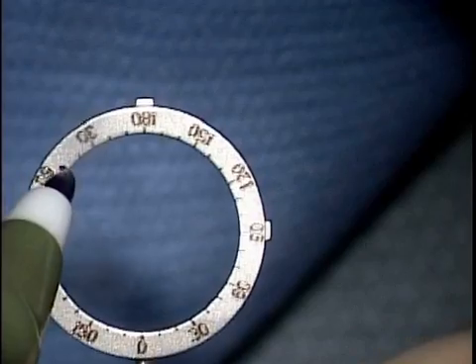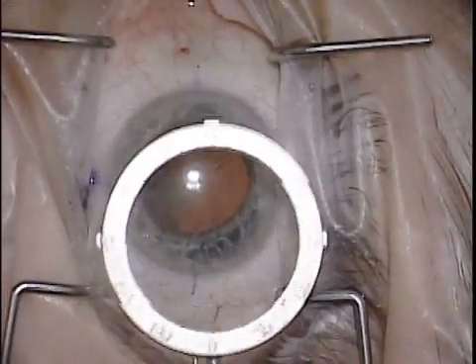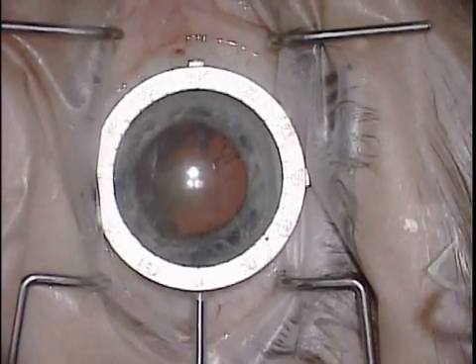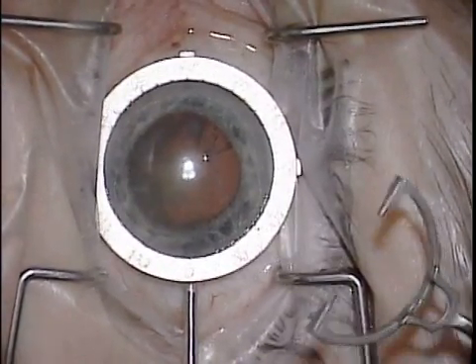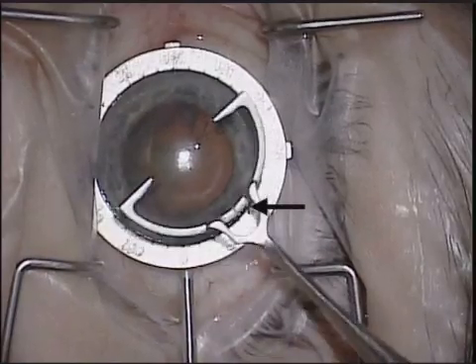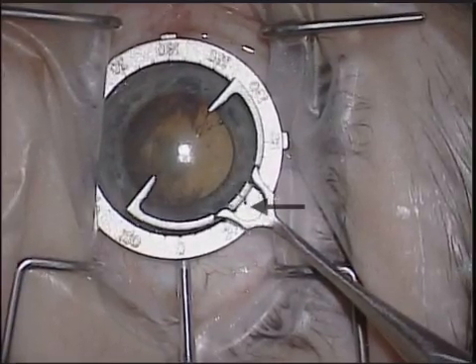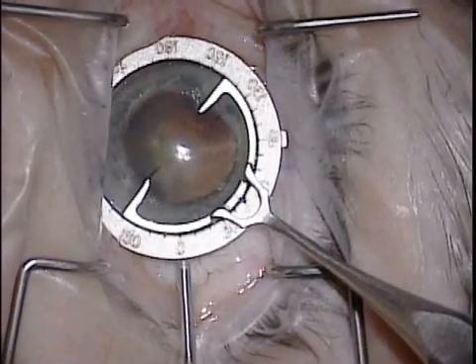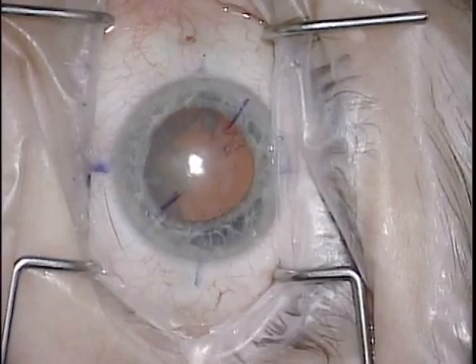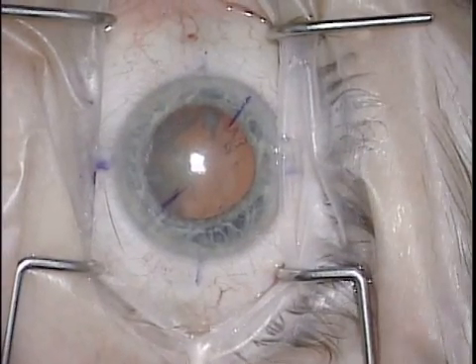To speed axis identification, the face of the degree gauge was marked on the minus axis. Then the index alignment at the center of the half-circle marker was aligned on that mark and the handle rotated toward the cornea to bring the marking bars against the plus axis 90 degrees away. With that method, only one point on the degree gauge need be identified. Once again, if the degree gauge remains centered on the cornea, the lines will always be placed at each end of the diameter line bisecting the cornea.